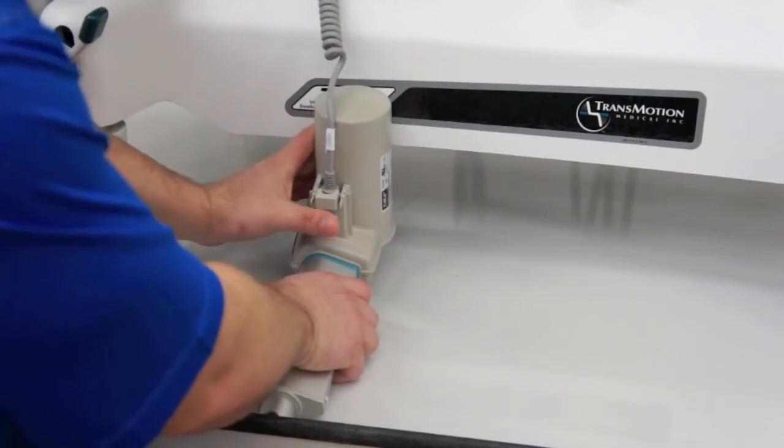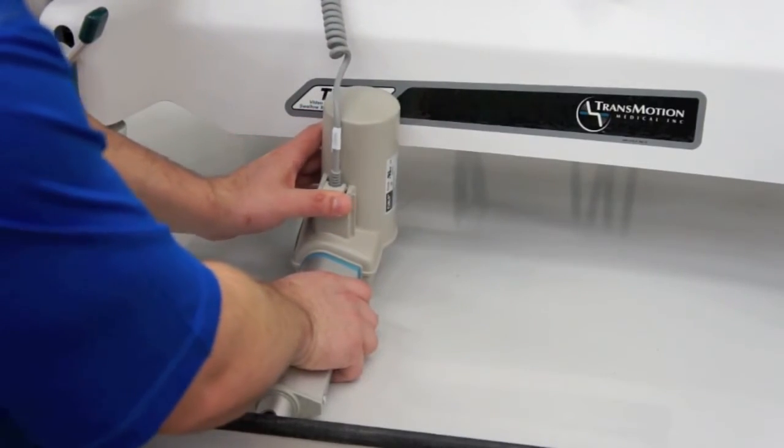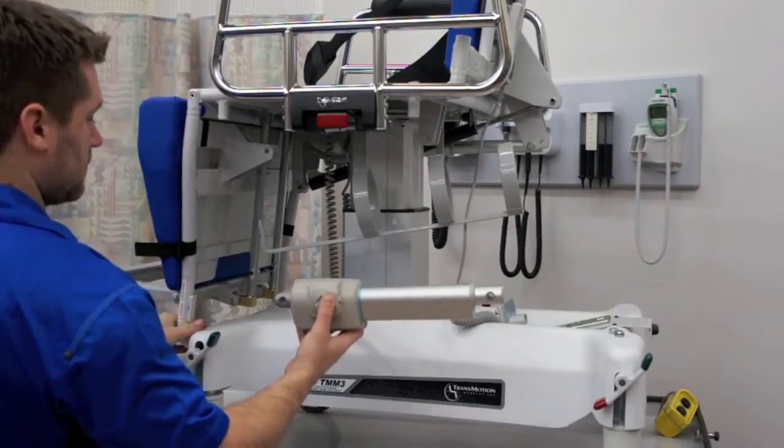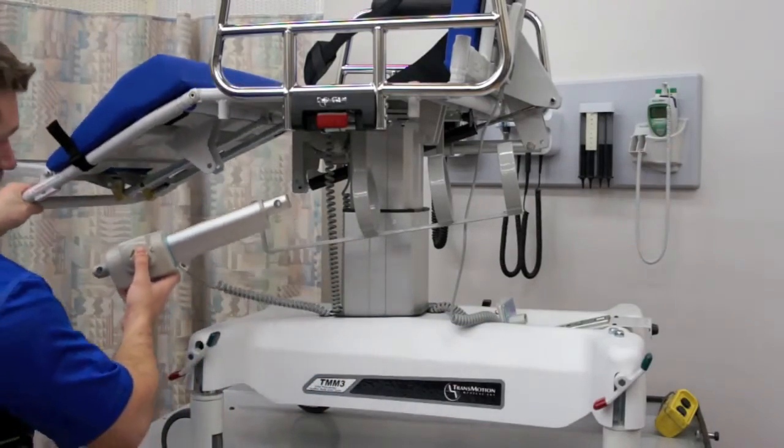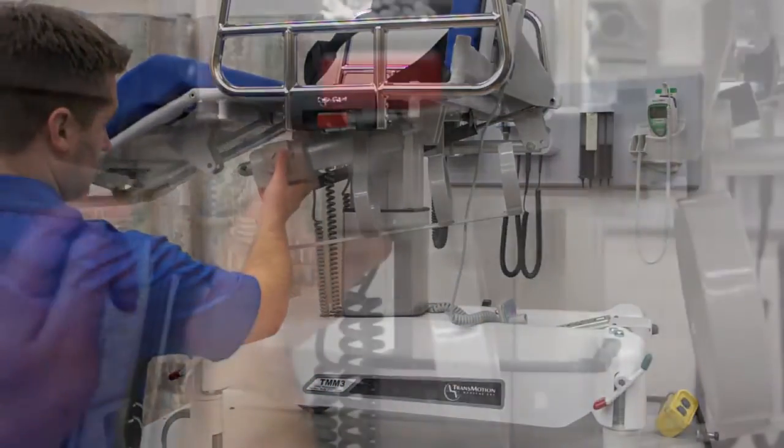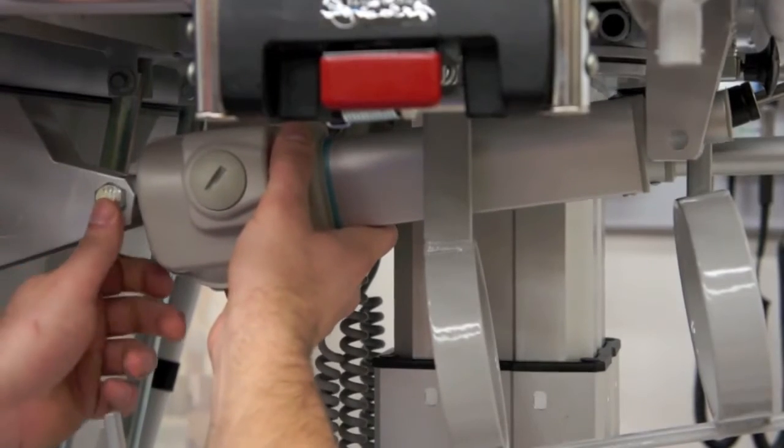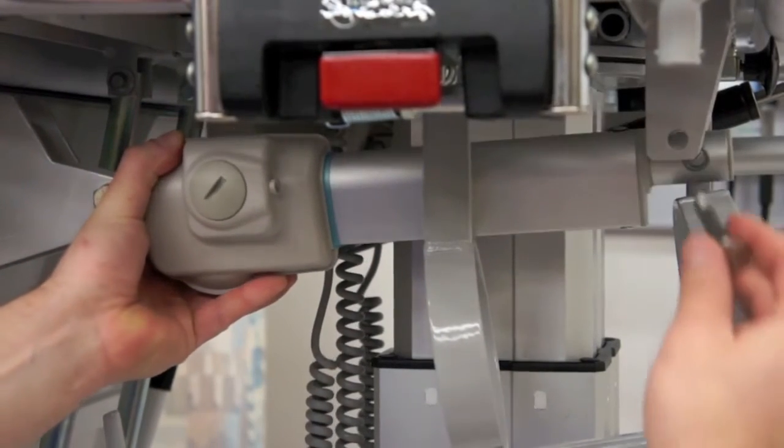Connect the new actuator and lock the retaining clip. Lift the leg section and slide the actuator with the motor side facing the column of the chair. Insert the bolts to the front and rear part of the actuator.